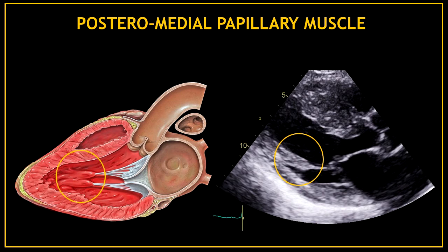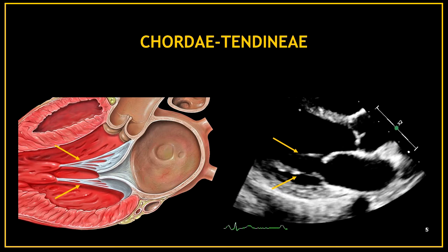Those chunky lines attached to the mitral valve are the papillary muscles. In this view specifically we can see the posteromedial papillary muscle. These thinner lines attached to the mitral valve leaflets are the chordae tendineae.